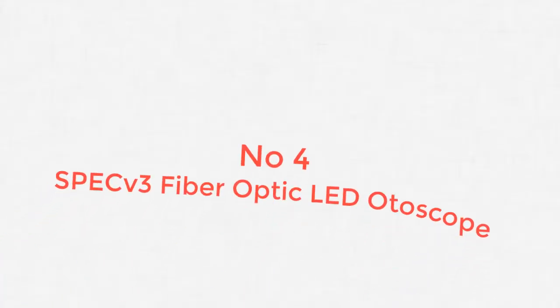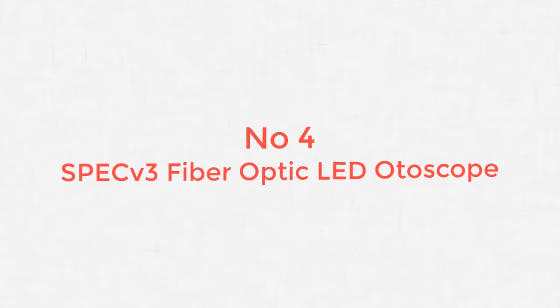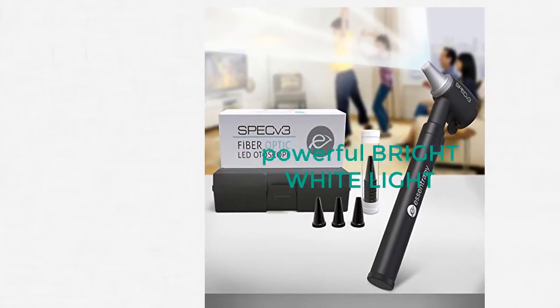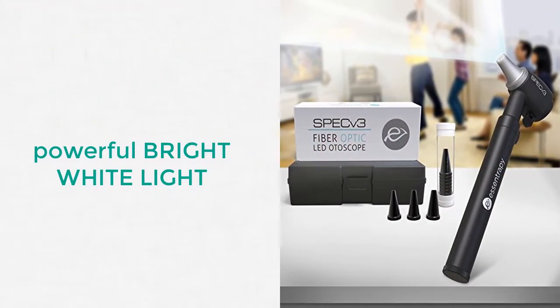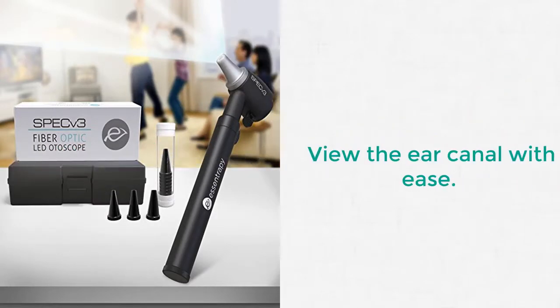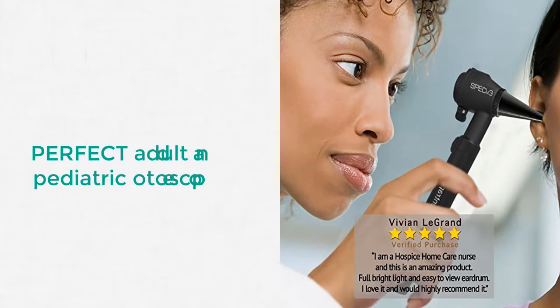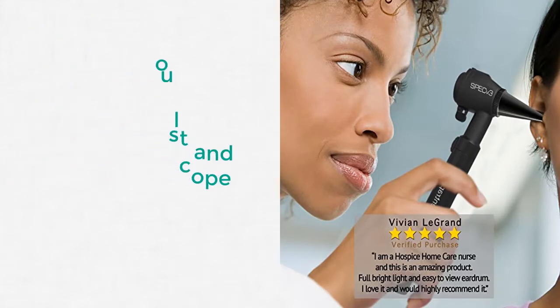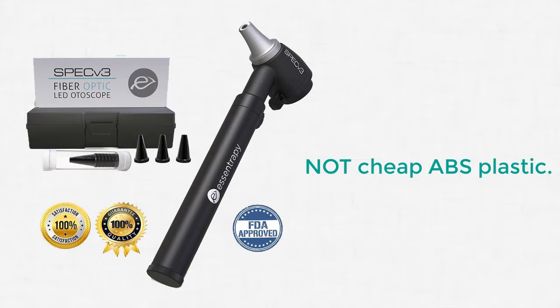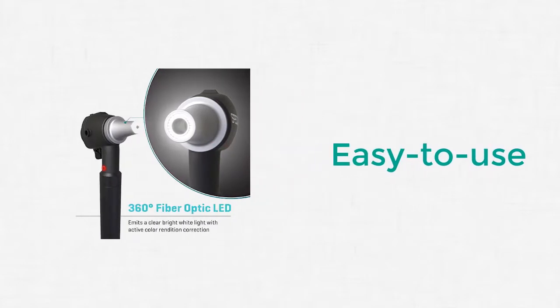Number 4: SPECv3 Fiber Optic LED Otoscope. The SPECv3 is a highly respectable otoscope priced affordably enough for most mainstream families to purchase. It features a powerful bright white LED bulb with CRC — color rendition correction — and true tissue color.